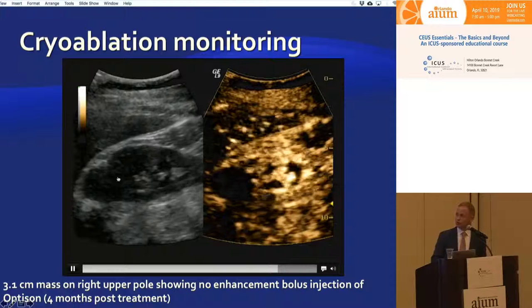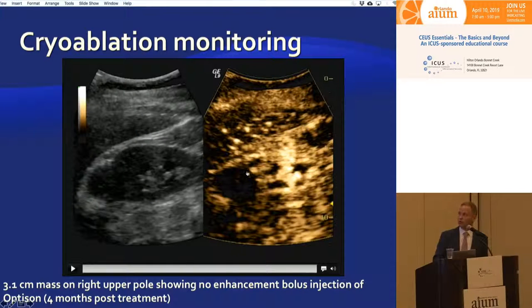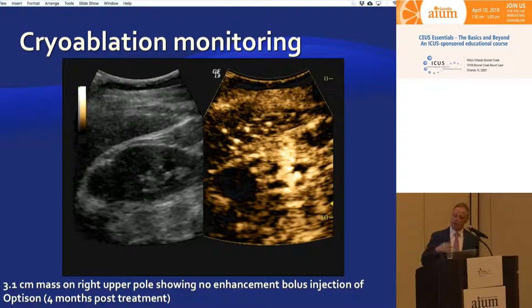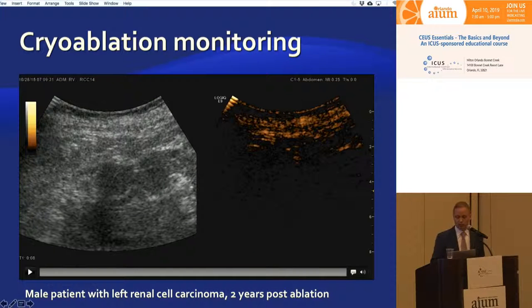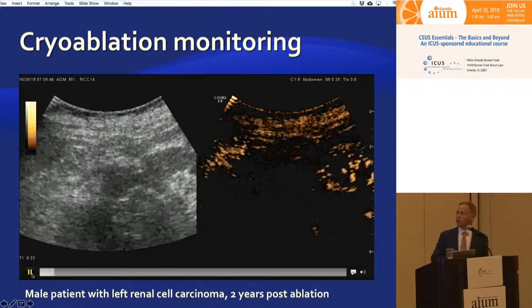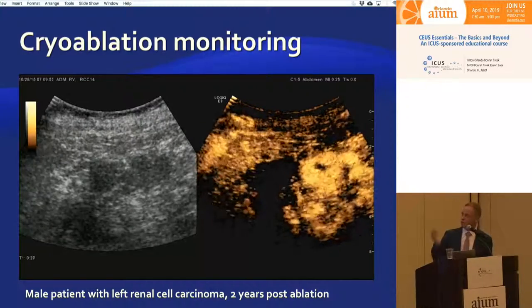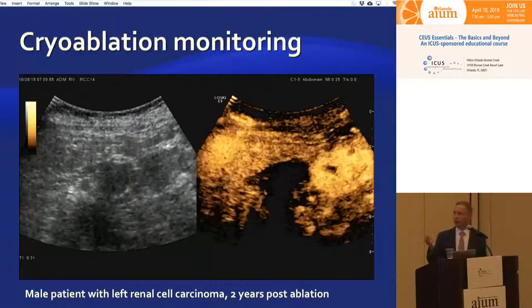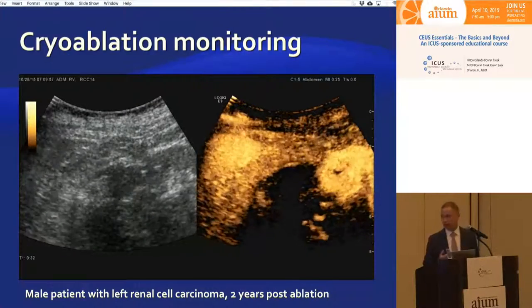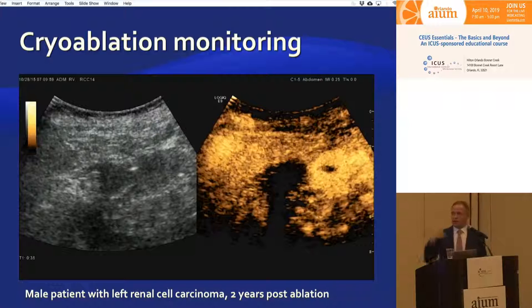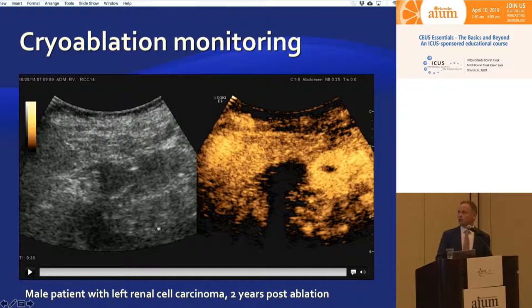In a patient with a cryoablation zone in the upper pole of the right kidney, on microbubbles there is not a single microbubble entering the area of ablation, confirming complete tumor response with nothing to worry about. Another patient with a similarly appearing B-mode kidney hypoechoic ablation cavity — after injecting ultrasound contrast, again not a single microbubble enters the majority of the ablation zone.